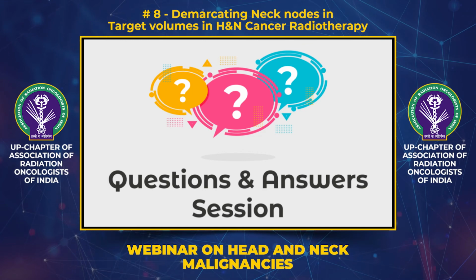And since the lymph nodes are less than a centimeter, that is subcentimetric, the chances of extranodal extension are less than almost 20%. So we need not take into account the muscles while contouring the CTV, but the whole lymph node station with the cavity part has to be taken into consideration. Okay, but if they are subcentimetric, then they should not be contoured separately as a GTV. No, they need not be contoured in GTV. Only the lymph node station is to be taken as an involved lymph node station.